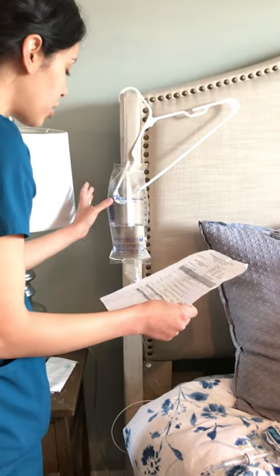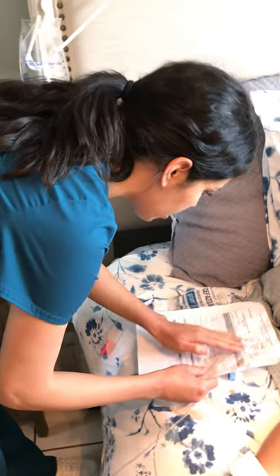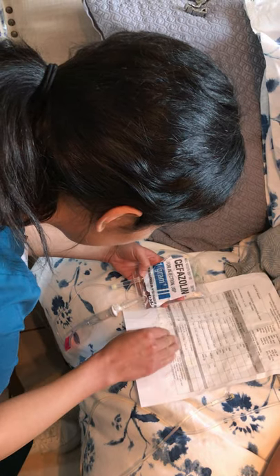I would remove my old gloves, wash my hands, and place new clean gloves. I'm checking that she has the correct fluids running at the correct rate — normal saline, not expired, open and running. Now for my third check: patient is Lotta Fallings, DOB 10/5/XX, allergies noted. I have Cefazolin 1 gram IV piggyback — correct route, correct dose, times 1 now, correct time, for infection, and it is not expired. Everything is correct: correct medication, dose, time, route, and not expired.